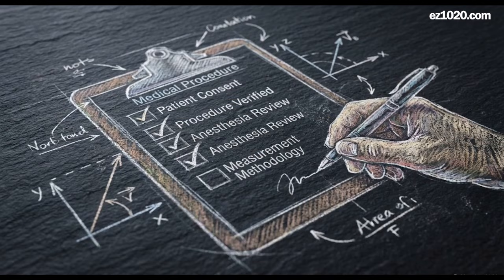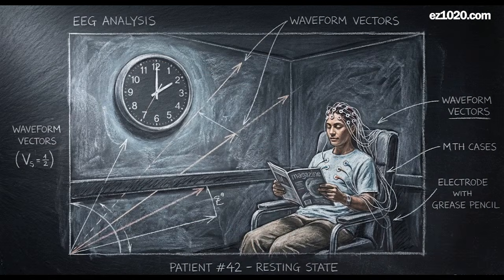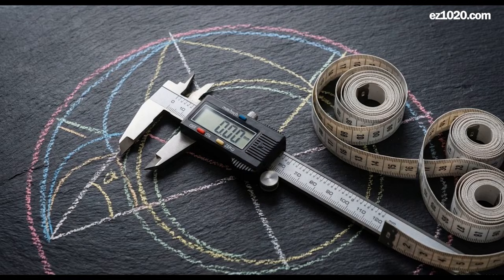Relying on visual shortcuts normalizes an undocumented deviation from clinical standards. It compromises the structural foundation of the test before a single electrical waveform is recorded. Many technologists justify estimation by arguing that a standard 30-minute routine EEG is not being used for pre-surgical epilepsy evaluation, assuming that millimeter-level precision is totally unnecessary.